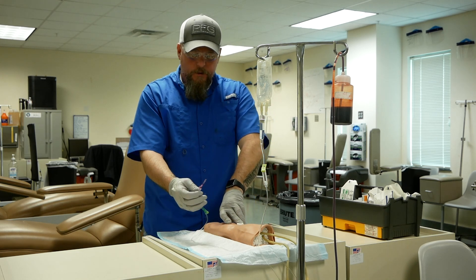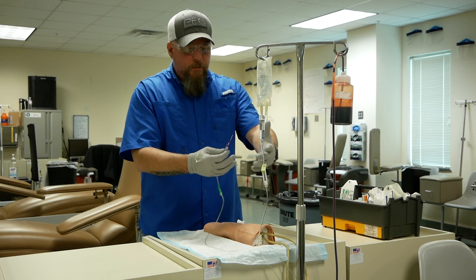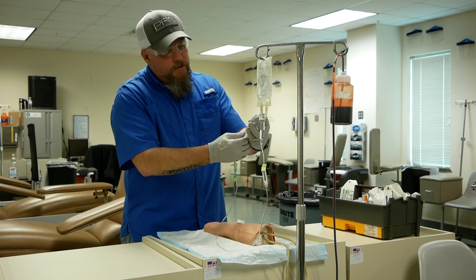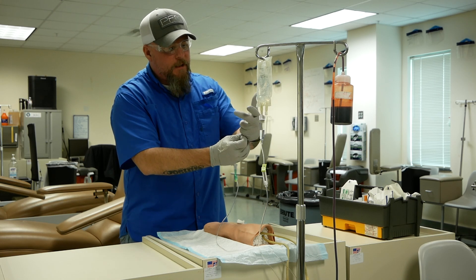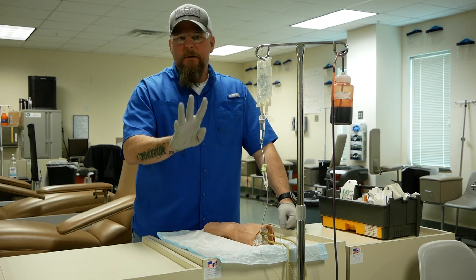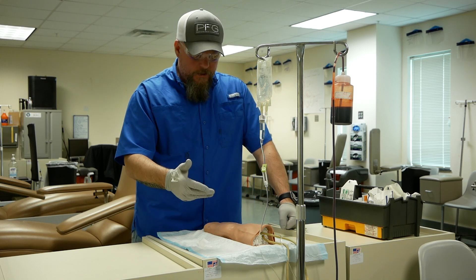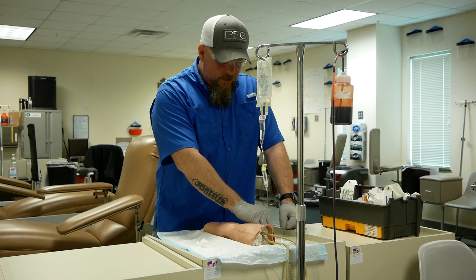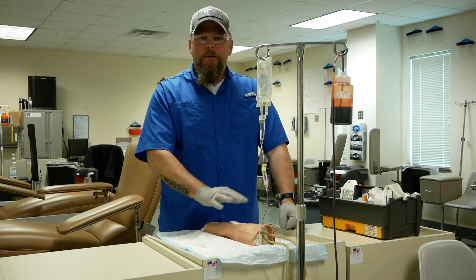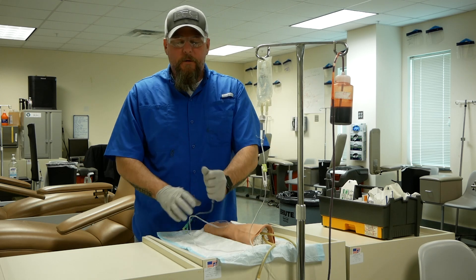Your patient is going to hold pressure for approximately 30 seconds, unless they're on anticoagulants, then it's five to ten minutes. Say that your patient is holding pressure, shield this from your patient, and inspect the tip integrity to ensure that it's intact. Once it's intact, close this up in your hand. Move your old gauze out of the way and inspect your site for four things using the acronym PEBS — P-E-B-S stands for pain, exudate, bleeding, and swelling. Once you inspect your site, take your new clean gauze, put it on, and verbalize that you would tape it. Once you tape your patient, you're done touching them — discard all bloody materials, doff your BSI, perform hand hygiene, and document.